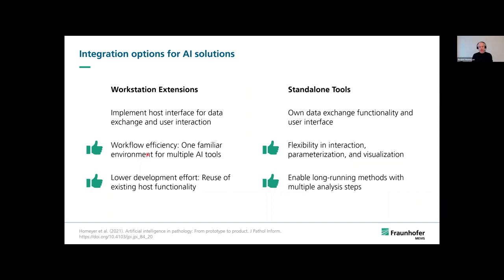On the other hand, standalone tools can offer more flexibility in interaction, parameterization, and visualization because they are not restricted to a particular interface. For the same reason, they are also often better suited for long-running analysis methods with multiple analysis steps that are not supported by all host interfaces. Implementing standalone tools can also be beneficial from a regulatory perspective, as the tools can be certified independently of their host application.